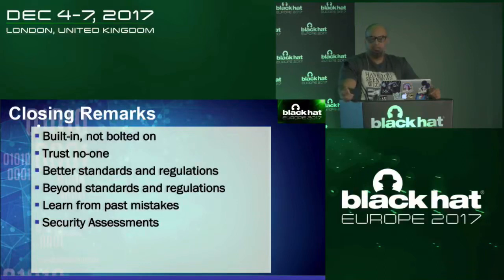The people more intelligent than I am should work on a framework that will allow these devices to securely connect to a network. And they shouldn't really trust any device until they're able to establish trust with that particular device. The FDA is doing a lot of good work. They're pushing a lot of manufacturers to implement security into their product. They're working on standards and regulations. So that's really good.